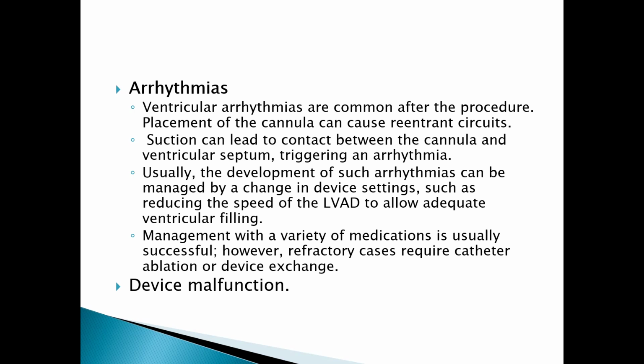Management with a variety of medications is usually successful. However, refractory cases require catheter ablation or device exchange. Then this is man-made, and after everything, there's also a possibility that this device can malfunction. So device malfunction is also a complication itself.